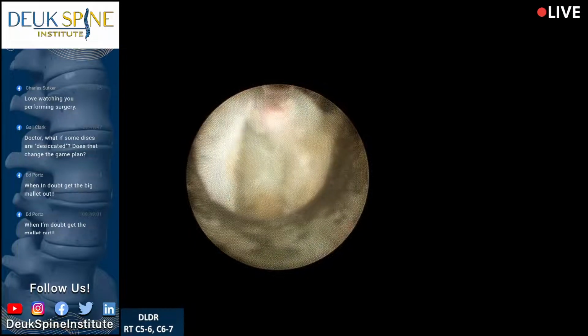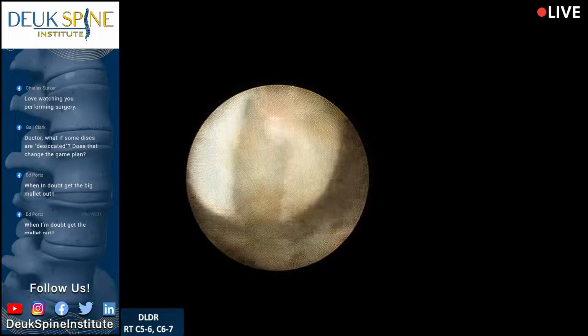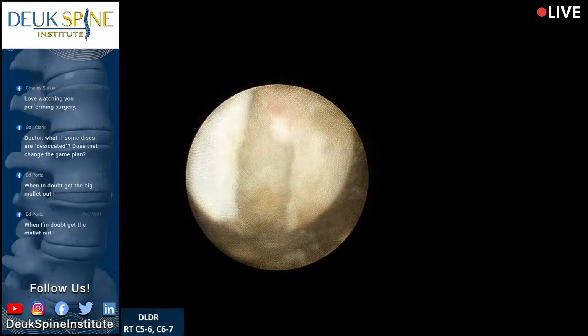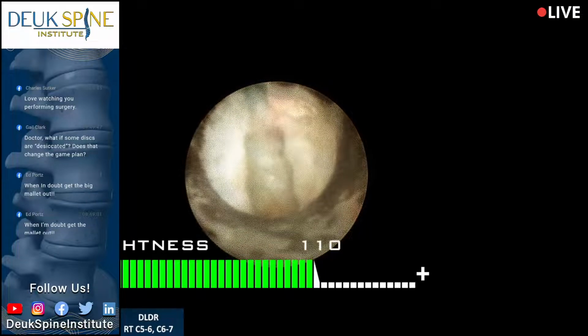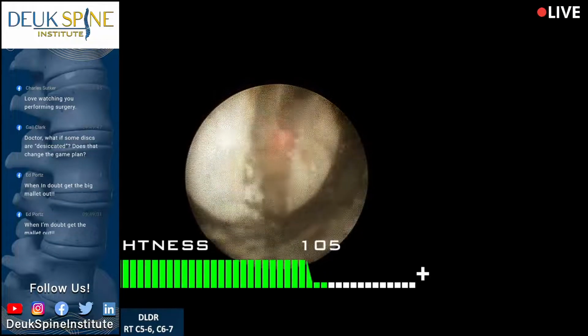I'm a little bit overexposed still, guys. Can we bring the brightness down? Yeah, please. Thanks. A little more. Yeah, that's better. Thank you.